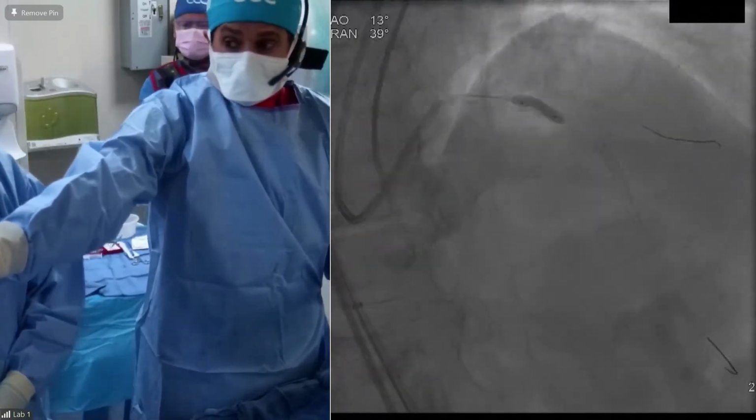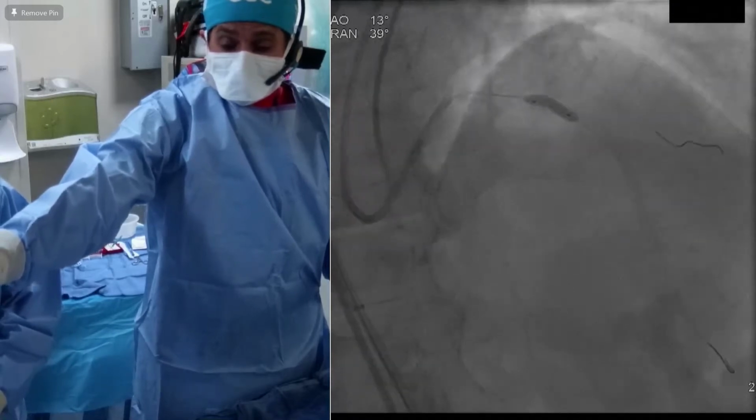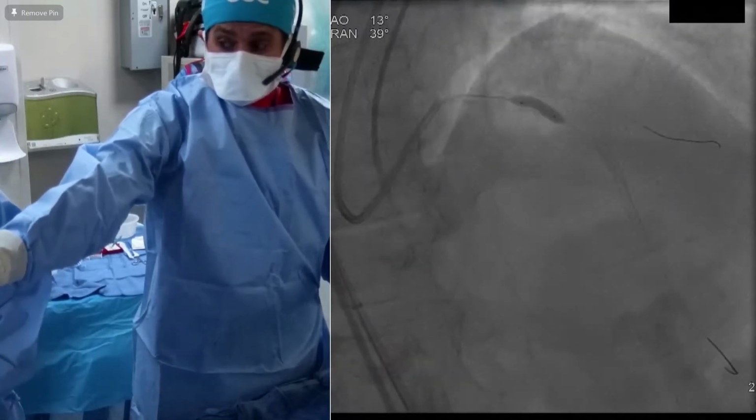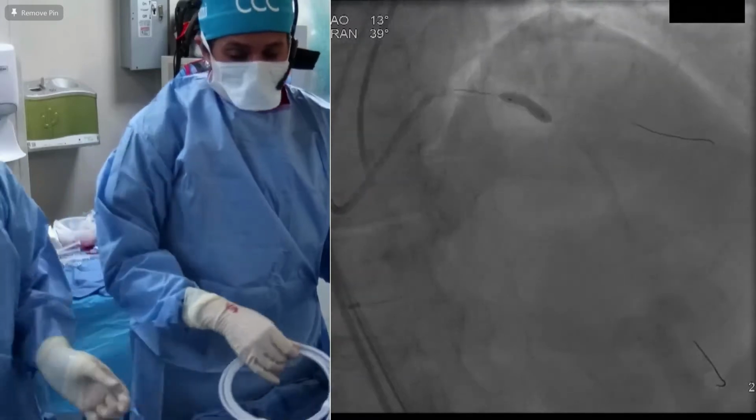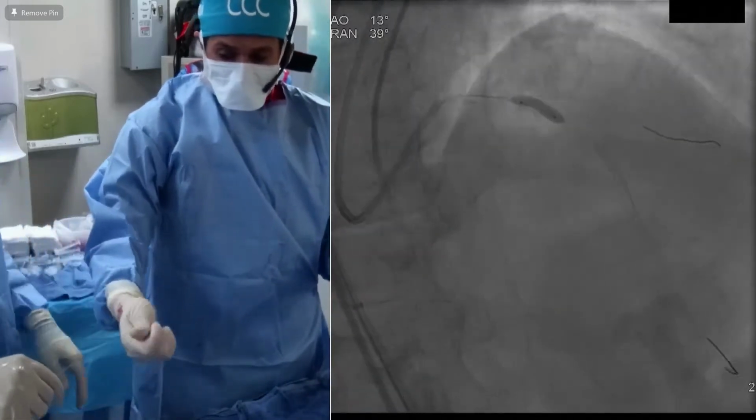Yeah, well, stenting across means that you have to match the stent to a very large diameter of the proximal vessel. That's what I was considering. If you compare to that little bump, maybe more than you think, whereas if you focus on the distal vessel, that's not so bad.